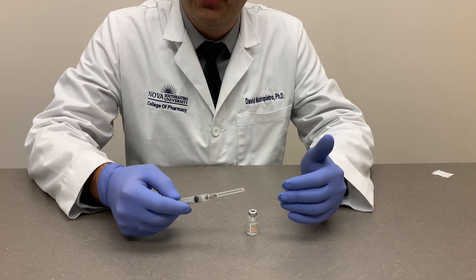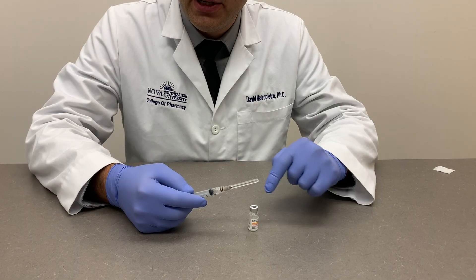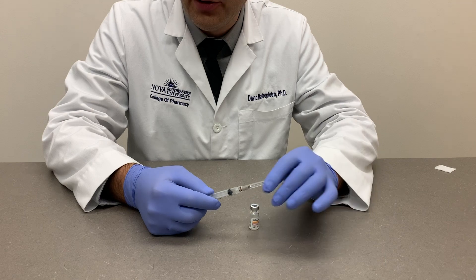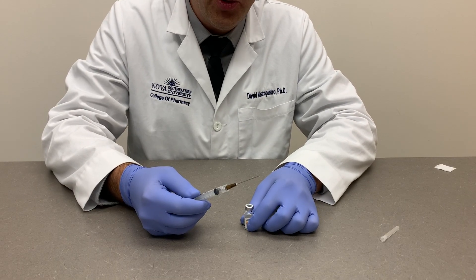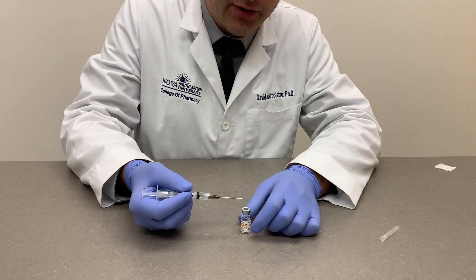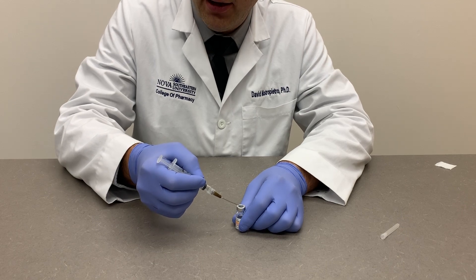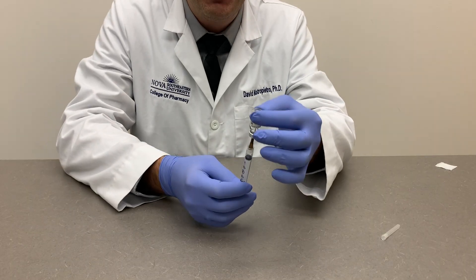When entering the vial, there is a risk of coring — where a small piece of the rubber septum becomes stuck inside the needle and is seen floating in the liquid drawn into the syringe, posing a risk to the patient. To minimize this, remove the sheath from the needle, hold the vial firmly on the table with one hand, turn the needle so the bevel is face up, and center it on the septum target. Apply slight downward pressure while rotating the needle to an upright position, then rotate the vial around.